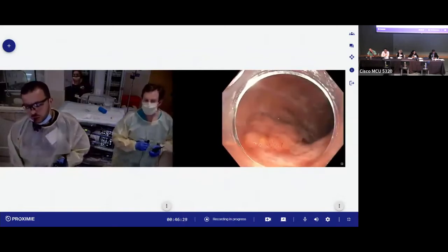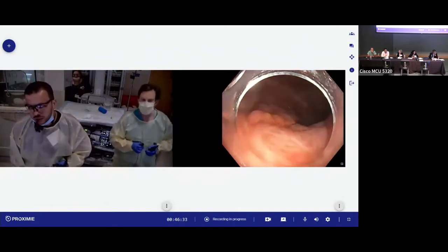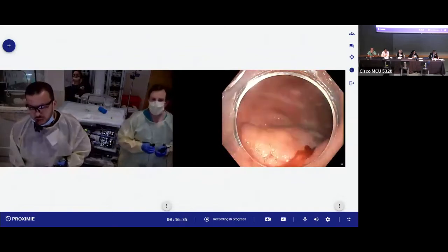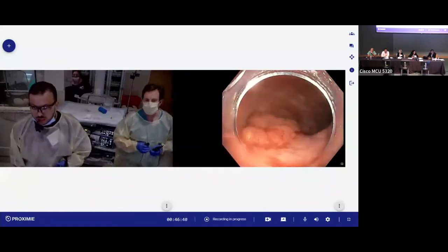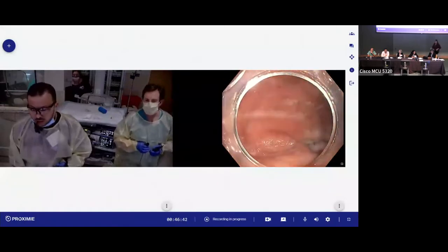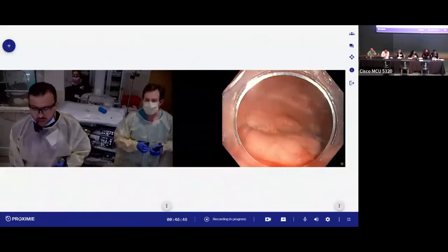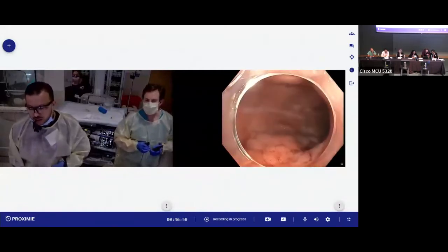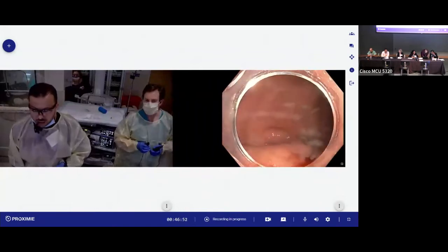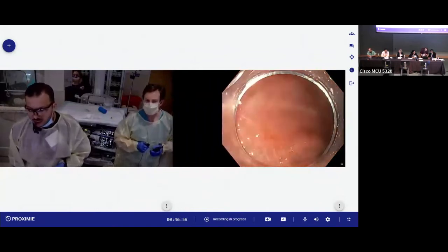So that's how we will basically distinguish dysplasia in IBD. Is it visible dysplasia or invisible dysplasia? That's the other thing to look at: is there any superficial ulceration as well, indicating also inability to resect this area. I think I don't see anything concerning on this lesion. I see very nice clear borders.